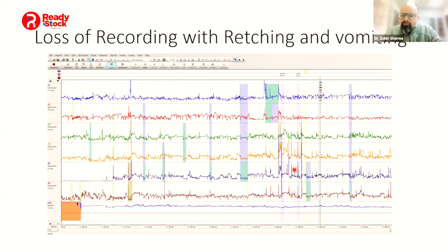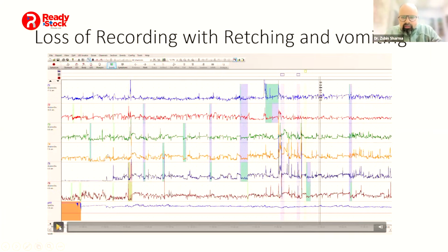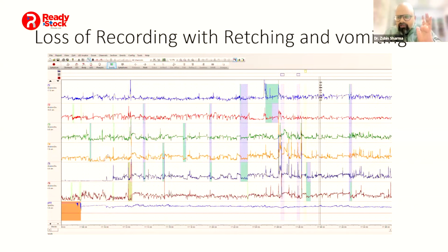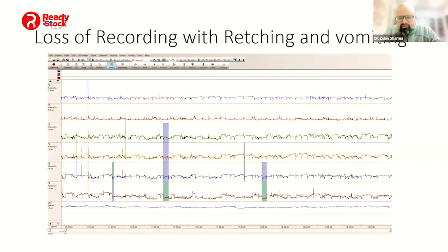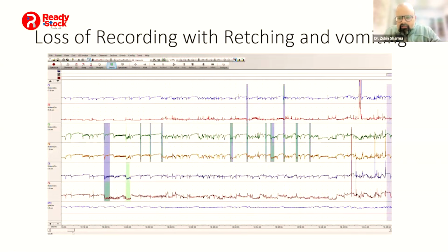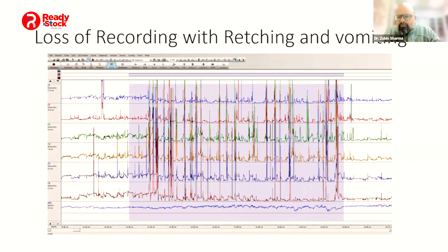Another young female who kept on retching, and I'll show you what went wrong. One second. Yeah, this is a video. Now, you can see a nice recording here. All things look very, very well. pH is in place. If you leave it at automated, what will happen? So as I go ahead, everything looks okay. Nicely done here. Patient had a lot of retching. You can see pH going up.